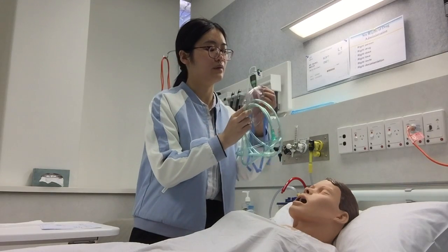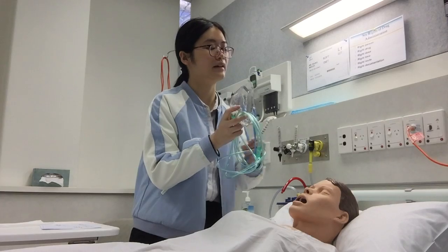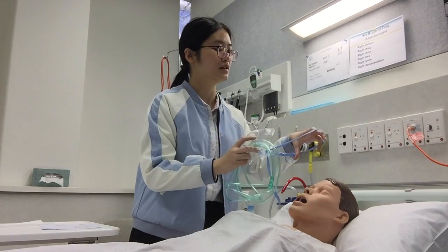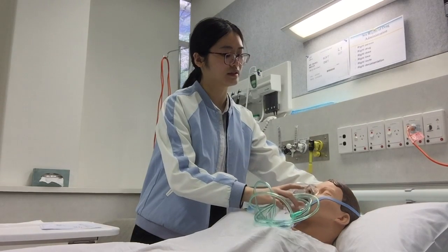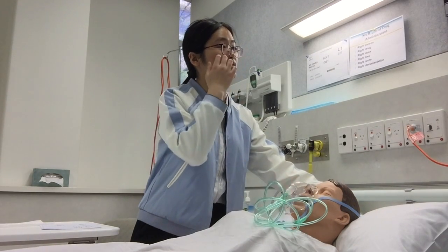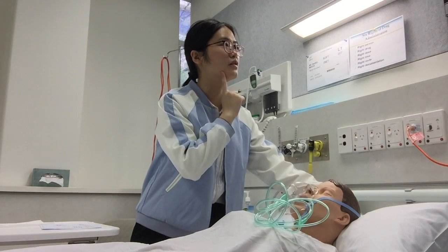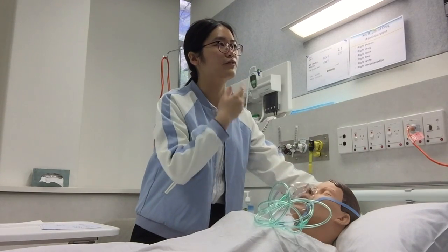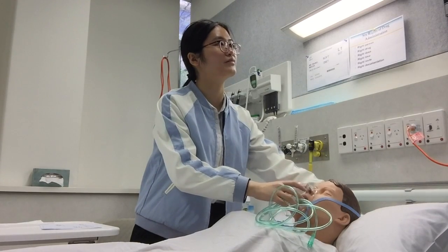The mask has a larger area around it and elastic straps. So always make sure that a tight elastic strap does not break down the skin around the patient. If it does not feel comfortable, the patient will feel very unwell.